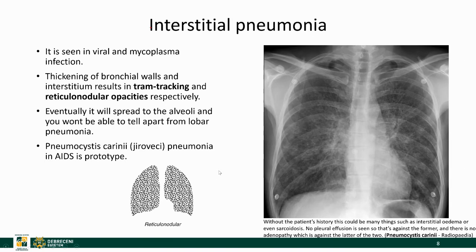Interstitial pneumonias are usually caused by viral or mycoplasma pneumonia — these are the atypical pneumonias. What you will see on the chest x-ray is a reticular pattern, similar to what we saw with lymphangitic carcinomatosis, though that was more localized. We also saw this pattern with cardiac edema, but cardiac edema shows peribronchial cuffing, Kerley lines, pleural effusion, and cardiomegaly — none of which we see here. This might also be caused by sarcoidosis, but sarcoidosis causes bilateral hilar lymphadenopathy, which is not apparent here. If we know the patient has AIDS, we would likely suggest this is Pneumocystis carinii pneumonia.